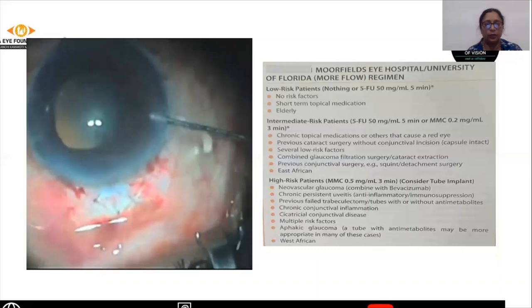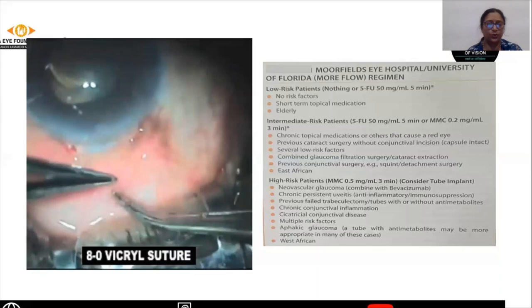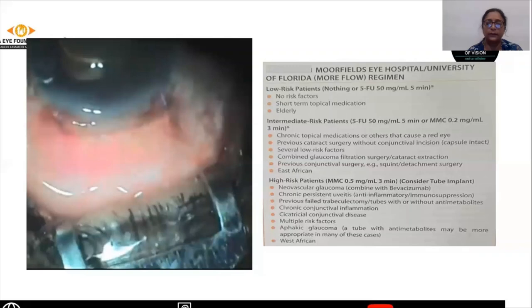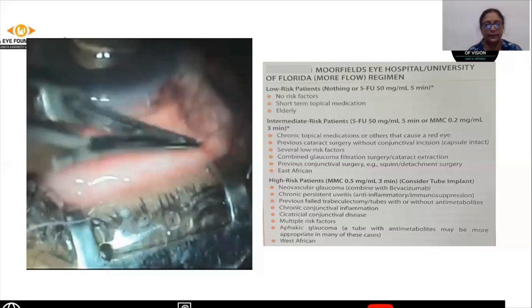You need to form the anterior chamber well and do a watertight closure of the conjunctiva using either the Vicryl suture or the nylon suture. The conjunctiva is sutured at the limbus and anchored to the episclera so that the conjunctiva does not retract back.